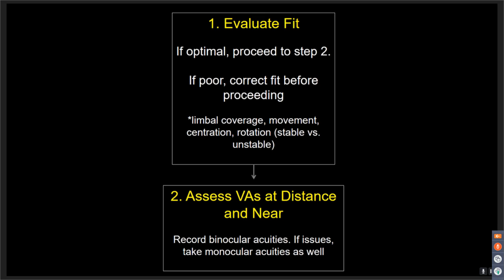You can walk through it with consultation. They may want to go with a larger lens. If they go with a larger lens, is it going to be aligned properly, or does it rotate? And if it does rotate, is it a stable rotation where you just have to adjust the powers, or is it moving? So it has to be a good fit, number one.